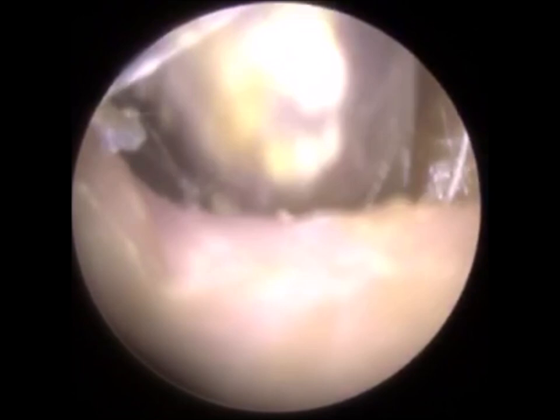Just using the Jobson Horne, just trying to get in behind this, but the entrance of his ear canal, because of the cauliflower ear, it's very difficult to extract and retract. That cauliflower ear, also known as a wrestler's ear or perichondrial hematoma, does make the cartilage almost like bone. It's very stiff, so it's very difficult stretching this ear open, trying to get the instrument in behind. And you can see again, very damp in there. So whenever you lift some of this dead keratin off the canal wall, it just oozes all this fluid or this dampness that's present because of the dead skin.